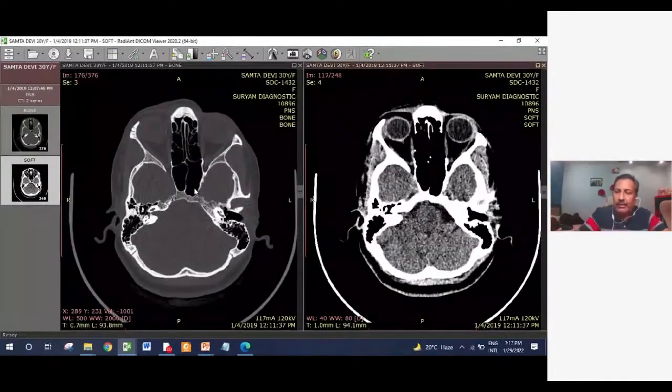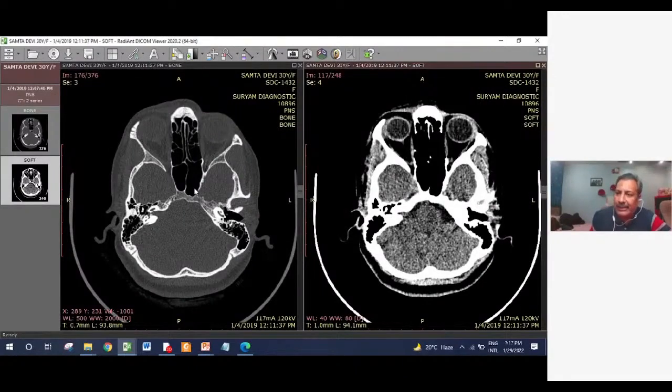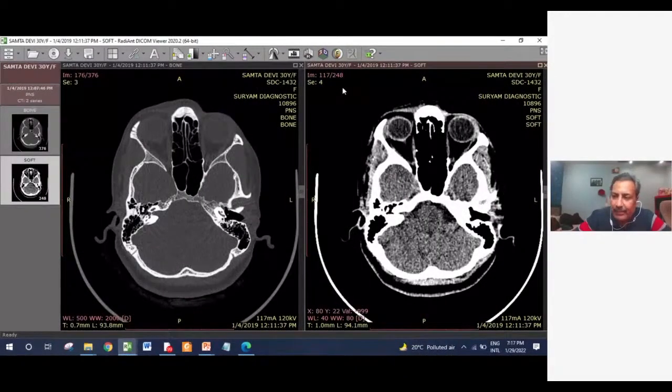You order a CT scan and you get finally a radiologist report for a sinusitis patient that the patient has bilateral pansinusitis. That's it. What does it mean? The patient has a bilateral pansinusitis by and large. What all we need is a detailed anatomy in three-dimensional planes, the more and more anatomical information for which the CT scan is ordered.